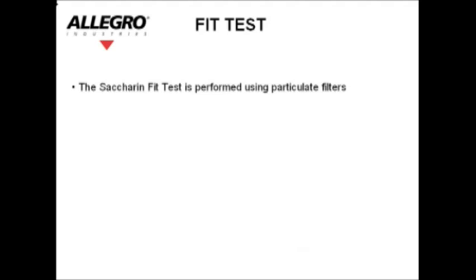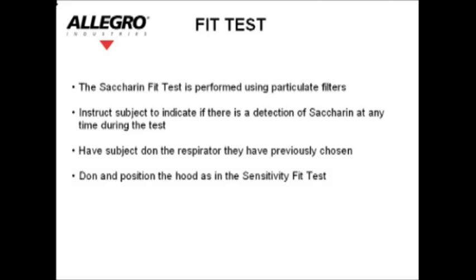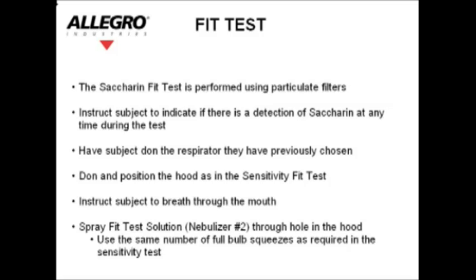The saccharin fit test is performed using particulate filters. Instruct the subject to indicate if there is a detection of saccharin at any time during the test. Have the subject don the respirator they have previously chosen. Don and position the hood as in the sensitivity fit test. Instruct the subject to breathe through the mouth. Spray the fit test solution — nebulizer number two — through the hole in the hood, using the same number of full bulb squeezes as required in the sensitivity test. Inject one half of the number of squeezes used above every 30 seconds.